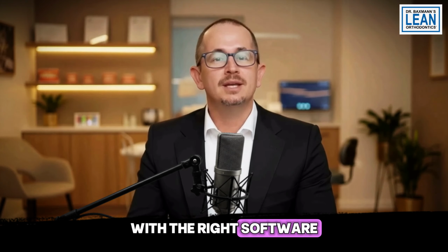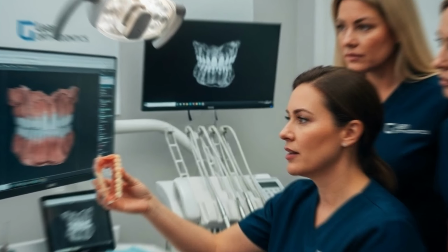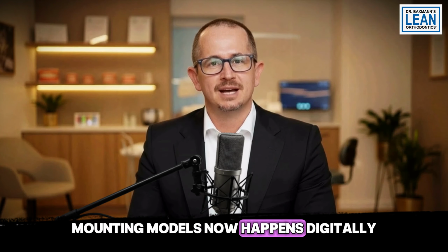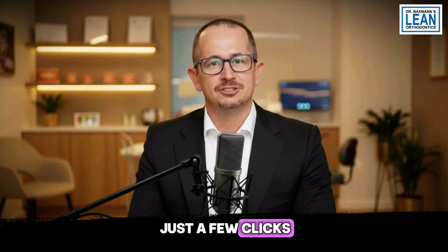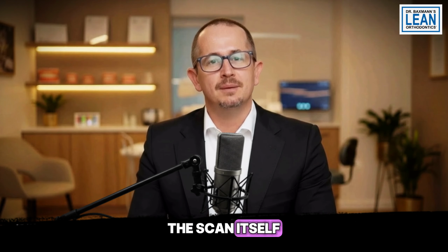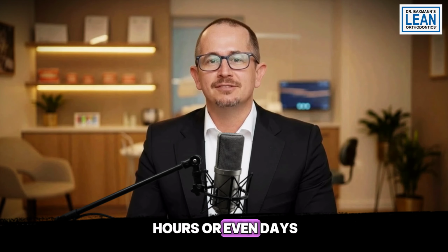With the right software, raw scan data can be trimmed, based, aligned, and labeled virtually. Everything a technician used to do manually, pouring plaster, creating bases, mounting models, now happens digitally. Upper and lower jaws can be aligned perfectly, leveled, and prepared with just a few clicks. This is where the real-time savings come in. The scan itself might only be marginally faster than a conventional impression, but post-processing eliminates hours or even days of downstream work.